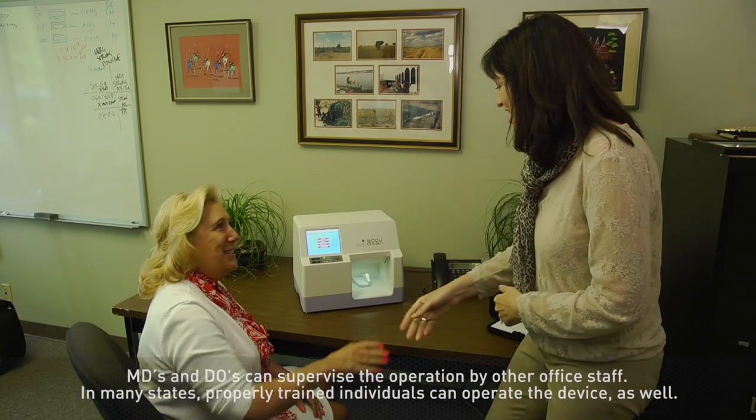The test itself exposes patients to less radiation than an average day on the earth. We designed the AcuDexa 2 so that anybody in the physician's office can use it.